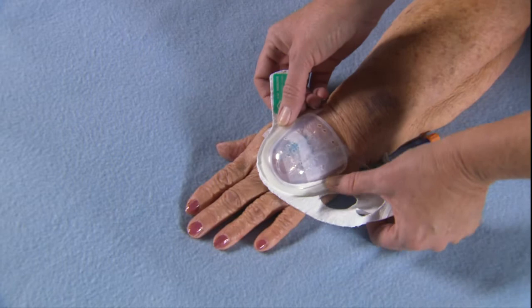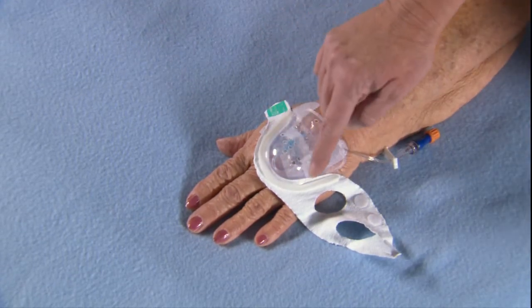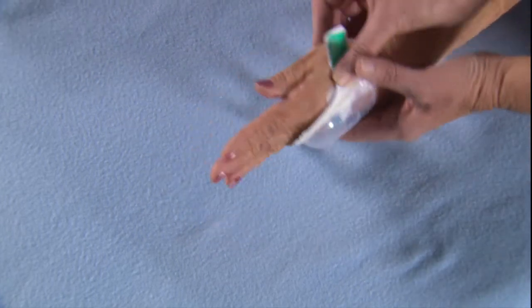Position the IV House Ultra-Dressing over the loop of tubing and catheter hub, with the round edge of the dome towards the fingertips. Wrap fabric around the palm, securing with Velcro.